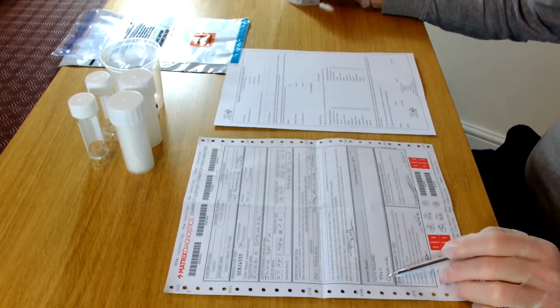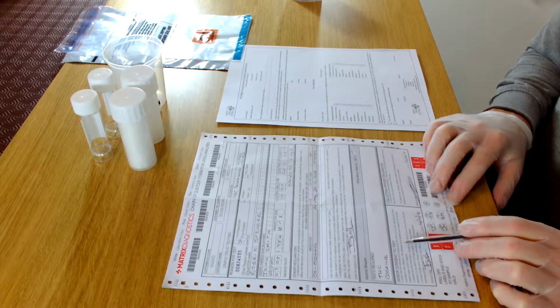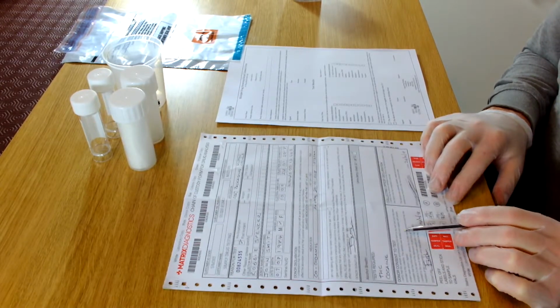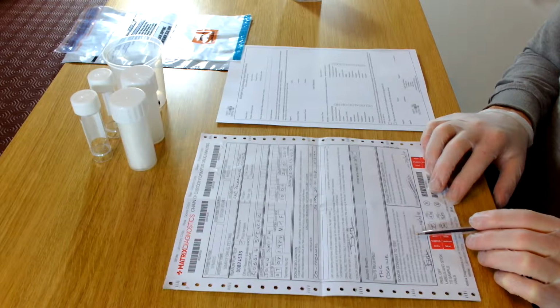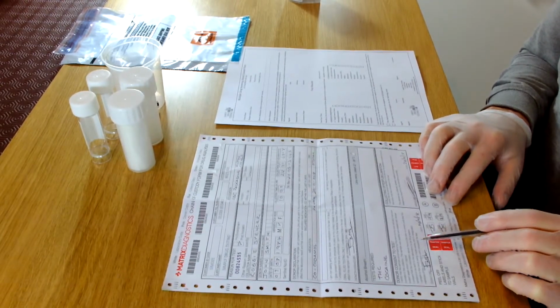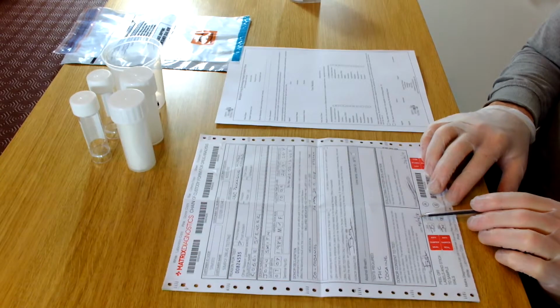There's then a donor consent section, and the statement says I certify that the sample accompanying this form is my own and has been provided to the collector. The sample was labelled and sealed with tamper-proof evidence seals, which I signed. I consent that the information about me on this form is correct, and this sample is to be sent to the laboratory to be drug tested. I consent to the result being made aware only to the designated members of the organisation who requested the test. The donor then signs in there and dates it in there.